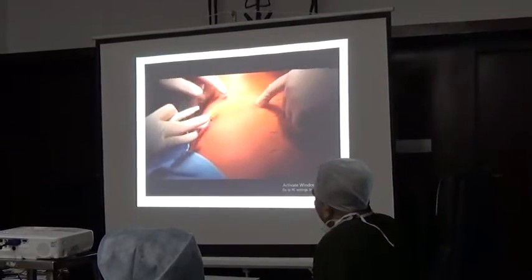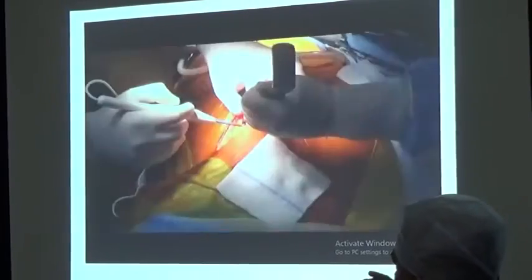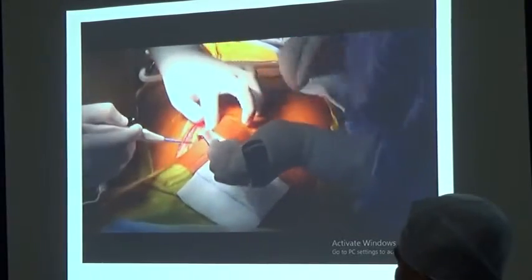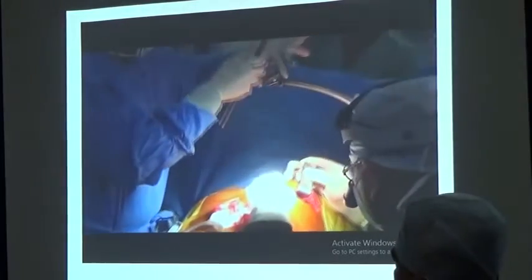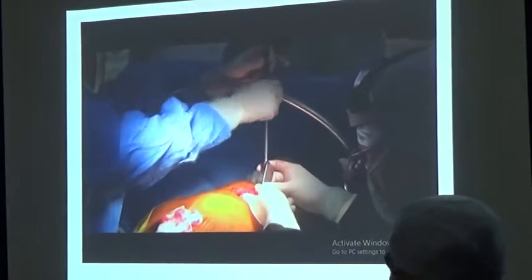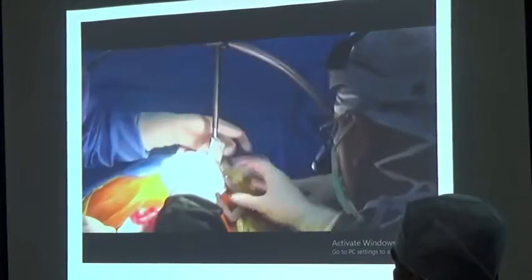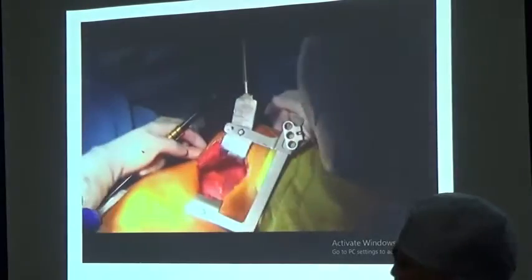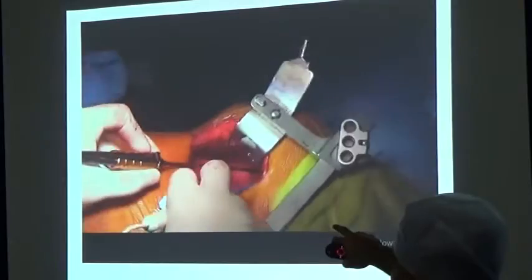Normally we keep a supine position, but in this, a little bit of elevation of the left side, and we have to mark all the sternal markings exactly, because in an emergency we need to open at any time. For the small incision, special instruments are required. This is a mini retractor, and you can see the rod. This retractor itself costs 5 lakh rupees for us. And we have to use a headlight because routine overhead lights will not work. The headlight costs us 4.5 lakh rupees. These are special retractors.